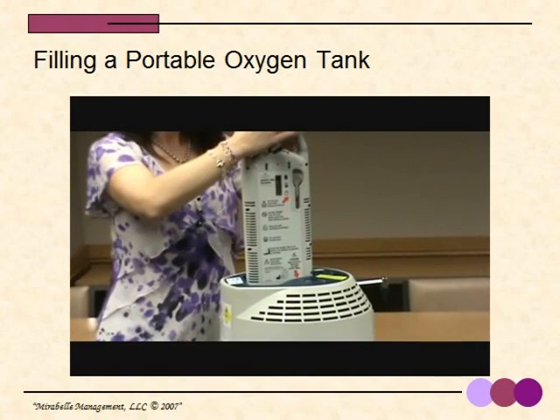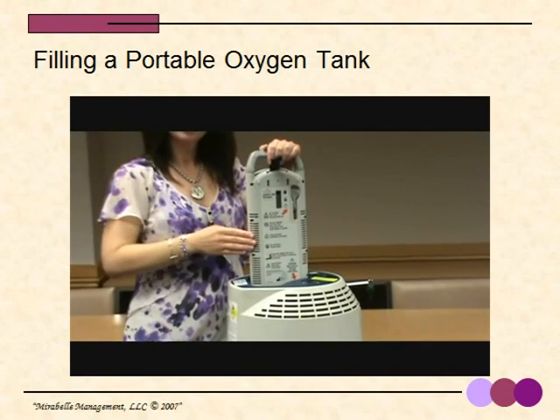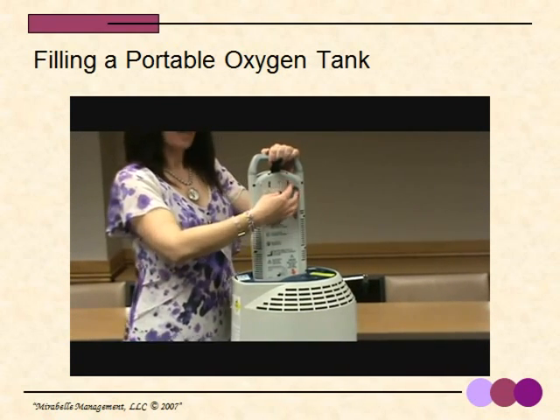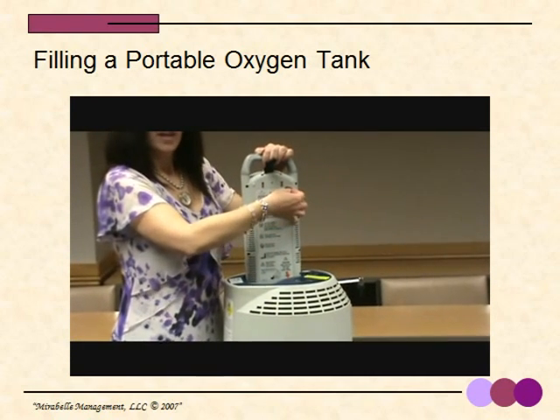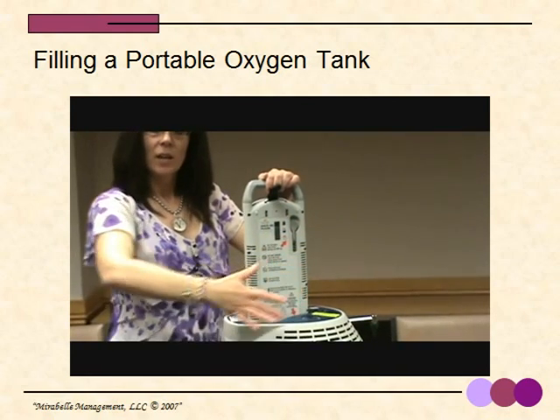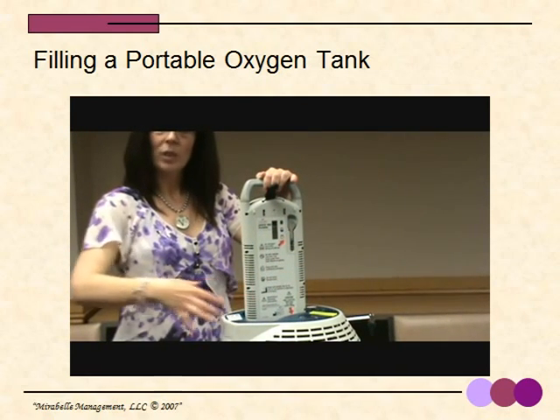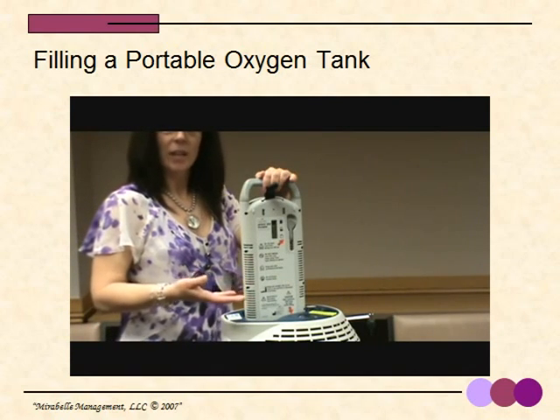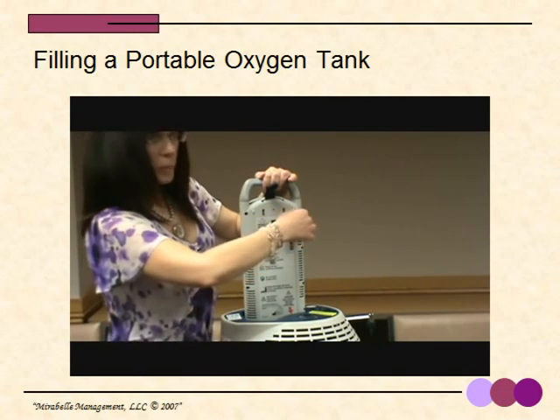Now for demonstration purposes, I will not be completely filling this portable, but I want to show you what we do. We pull down the lever and it will make a noise. And if we were completely filling this tank, you would eventually see vapor coming out much like a smoky mist, and you would actually hear a sound change as the tank was getting fuller. So we pull down the lever.